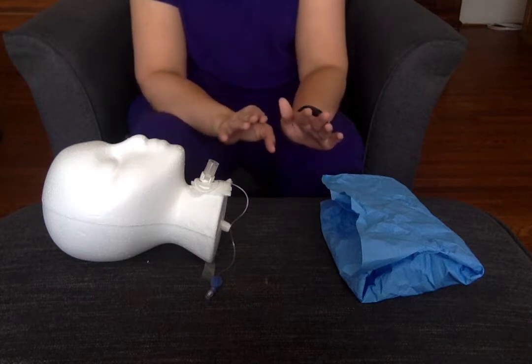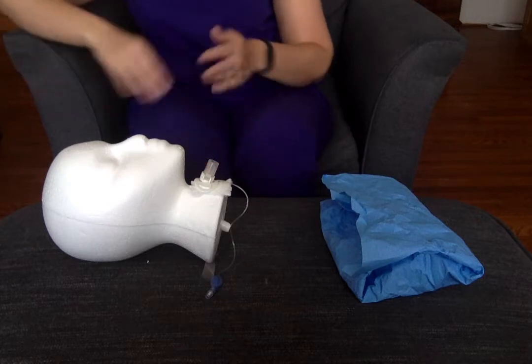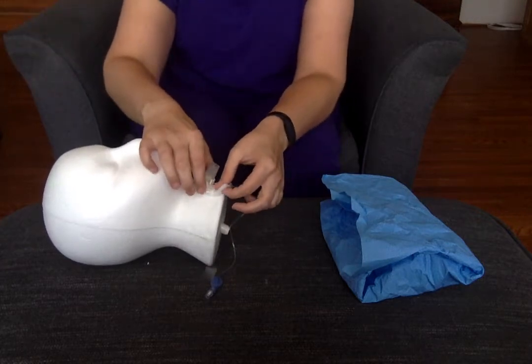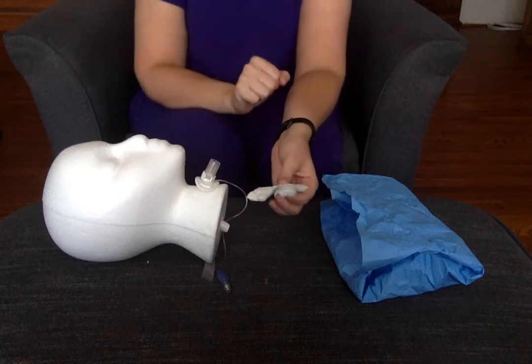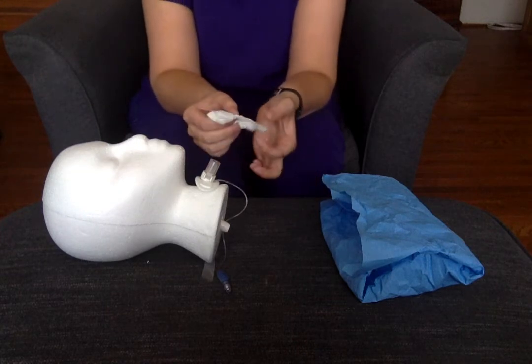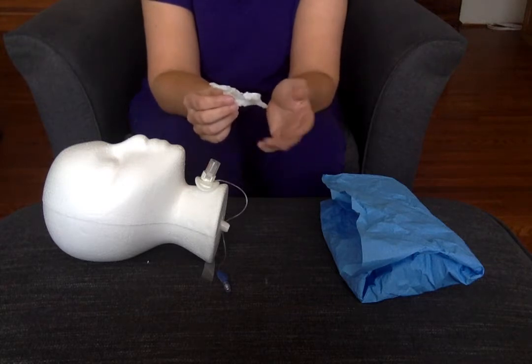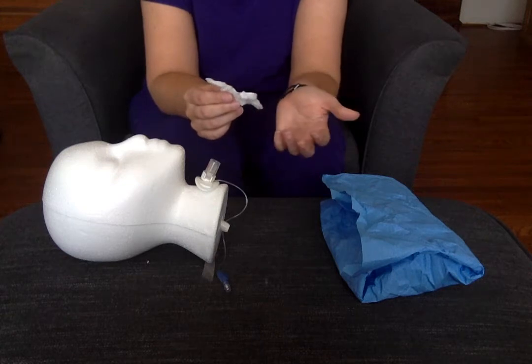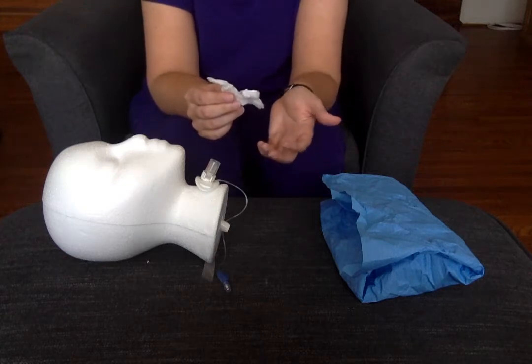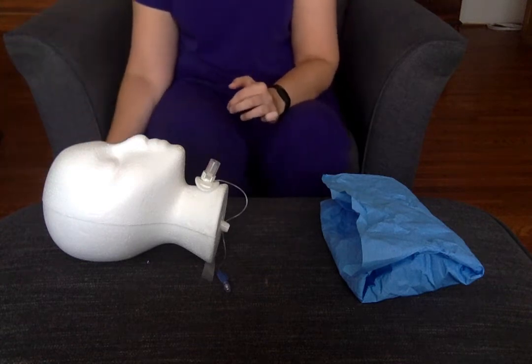If I wanted to change the dressing, what I would do is put on some regular gloves first and remove this old dressing. That way when I get sterile, I don't have to go back and do anything again. So just with my regular gloves, I'll look for COCA — color, odor, consistency, and amount. Maybe the patient has some small amount of thick yellowish sputum noted on here, no odor. Then I would throw this one out.